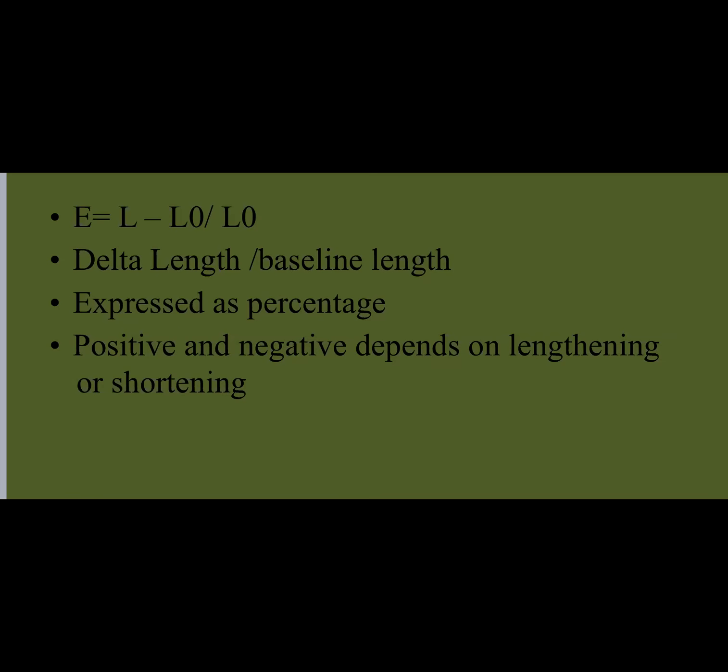So gradually you are replacing ejection fraction by strain, gradually. So sooner you won't hear about ejection fraction as much as you are going to hear about global longitudinal strain, GLS. So this GLS is going to replace EF, GLS and EF, okay? So what is the strain? Strain is L minus L0 over L0, meaning what?